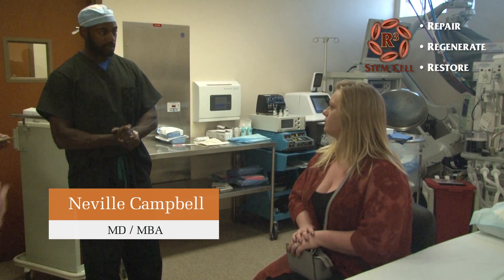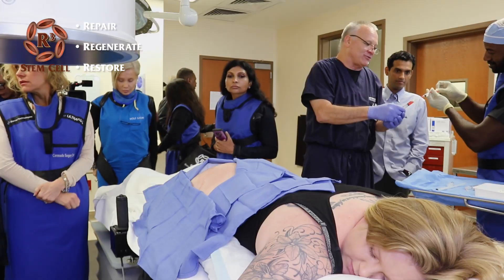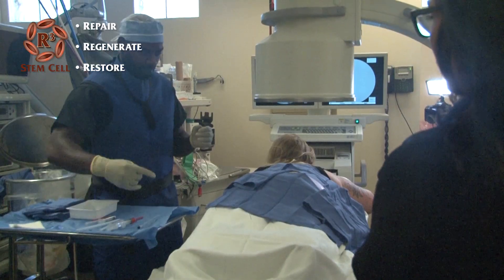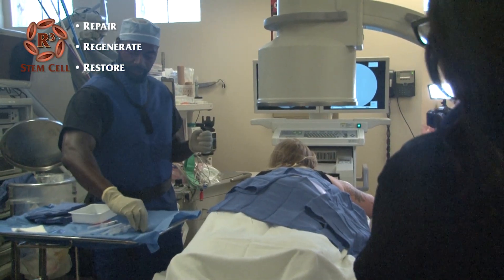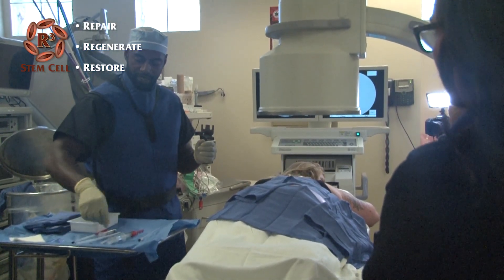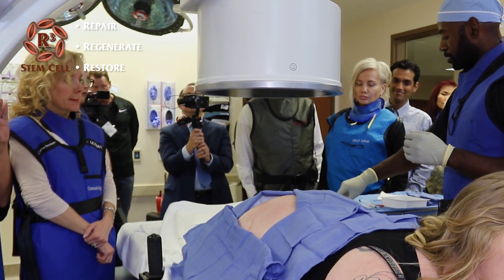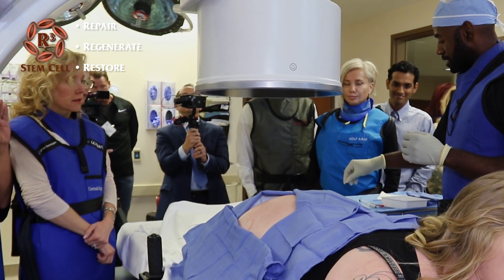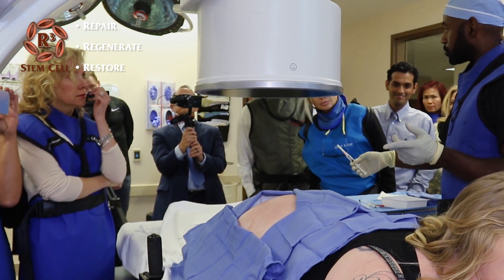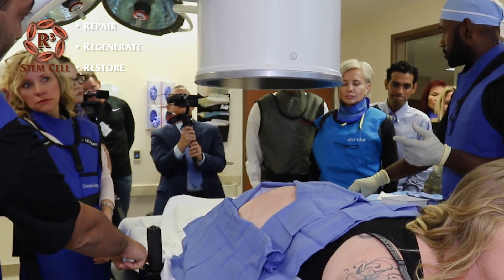All right, we're going to get set up and get this going. This is an appropriate size needle in terms of length — normally we use the three-and-a-half inch, which I'll put to the side. This mixture is for injecting our PRP and cells, and lidocaine for topical protection — not for in the joint, but for top protection. And this is our contrast media.